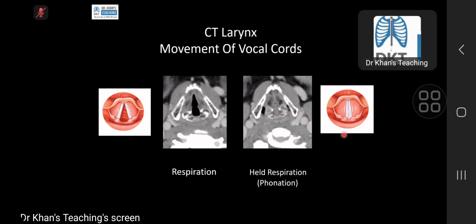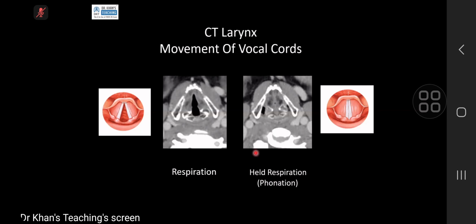So please remember that this boat shape might not be visible to you when you have scanned a case, because it all depends on whether the patient is in phonation. Classically, when we do a CT of the larynx, we call it the larynx protocol. It's a two-phase study. In phase one, we ask the patient to do shallow breathing or phonation. So we ask the patient to produce a sound like ah.